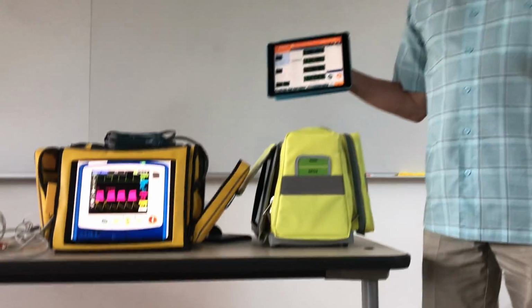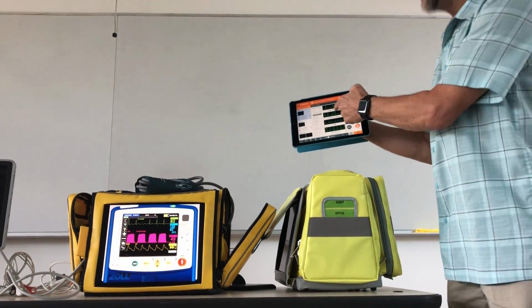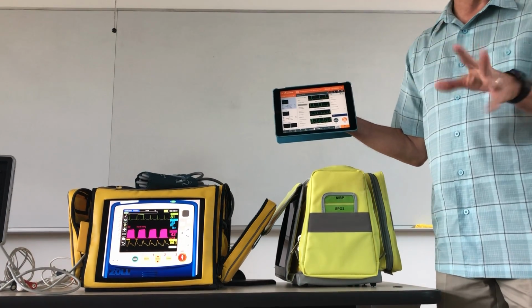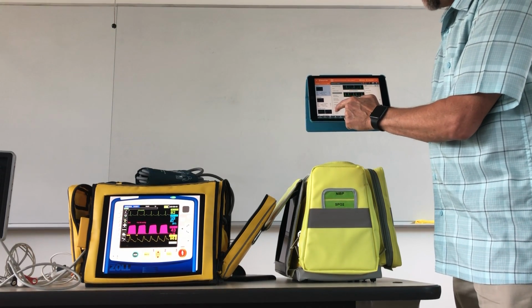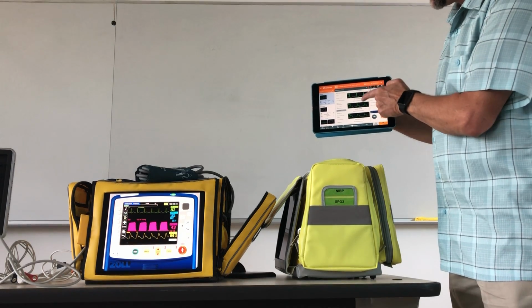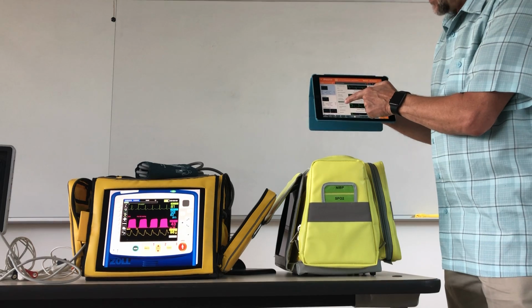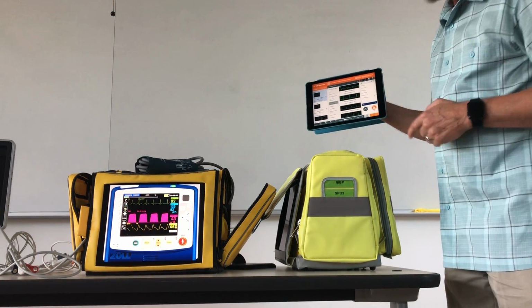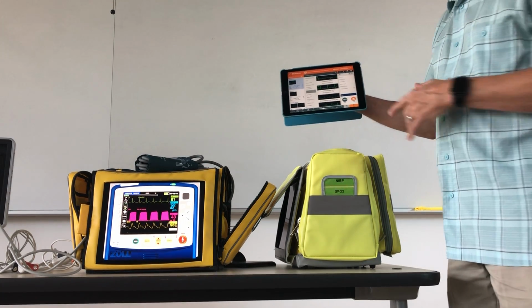So unlike the old rhythm generators, 2 differences. One, there's a lot more rhythms, but the other thing is you can see what they look like before you pick them to decide if that's the one that kind of represents what you're going for. And they've got a whole variety of ischemia. So you've got various ST elevations, MIs, ST depression. Actually, there's not that many in that category specifically. But the conduction abnormalities has all of your different heart blocks as well as some bundle branch blocks, different things.